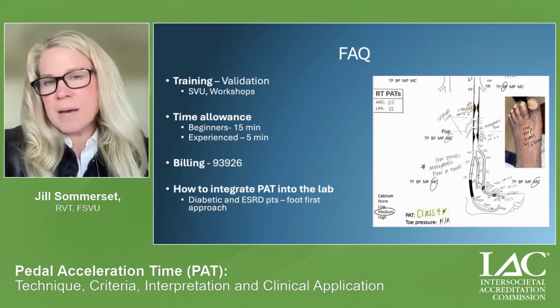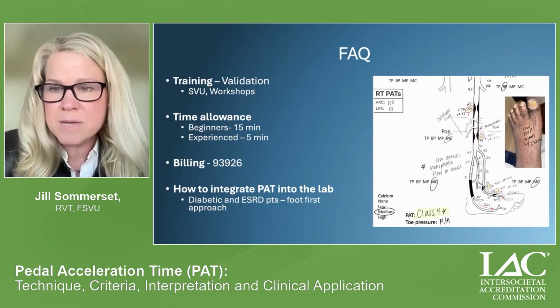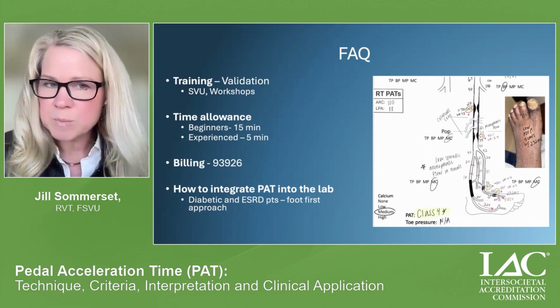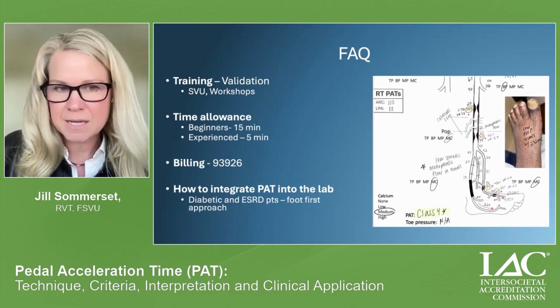And a lot of people ask about time allowance. Just like anything, it takes time to become familiar with the technique and the anatomy. So sometimes it may take you 15 minutes as you begin, but after you're experienced, it can be a fairly quick examination once you're familiar with the anatomy and the technique.